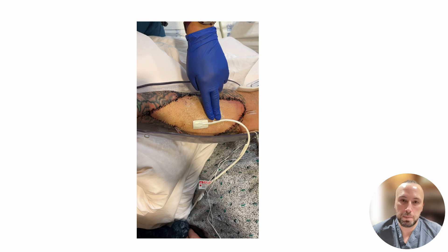If you're having trouble finding a Doppler signal, you should ensure no pressure is being applied to the flap, and you may want to reposition the patient to better find a signal. If you cannot find a Doppler signal despite these maneuvers, this could indicate a problem with blood flow to the flap, which could require urgent attention, so you should contact your surgeon.